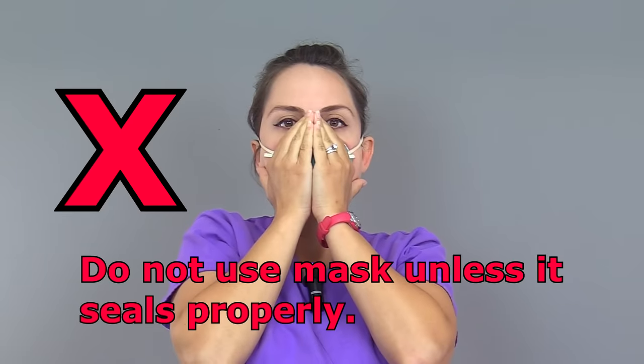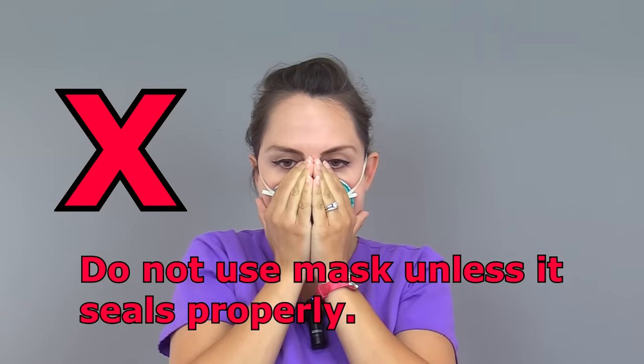If leaking air around the nose piece, try re-bending the nose piece with both hands and re-check the seal. If air is leaking around the respirator's perimeter, try re-adjusting the straps and re-check again. Make sure the respirator is not being affected by any piercings, facial hair, or glasses, which could prevent a proper seal. If the respirator still leaks after this, you may need a different size or type of respirator before use.